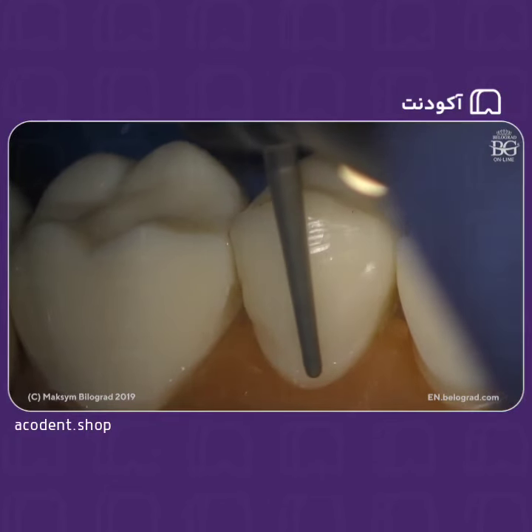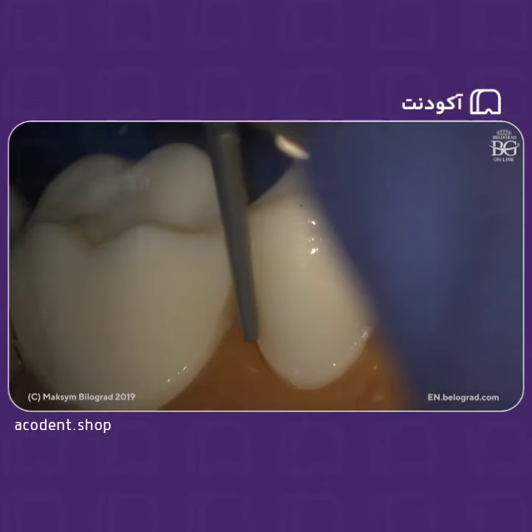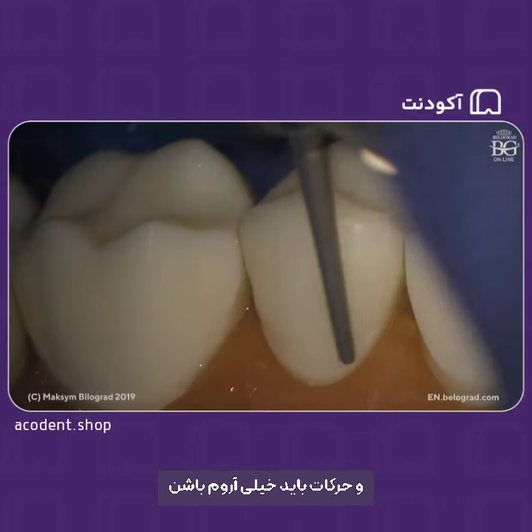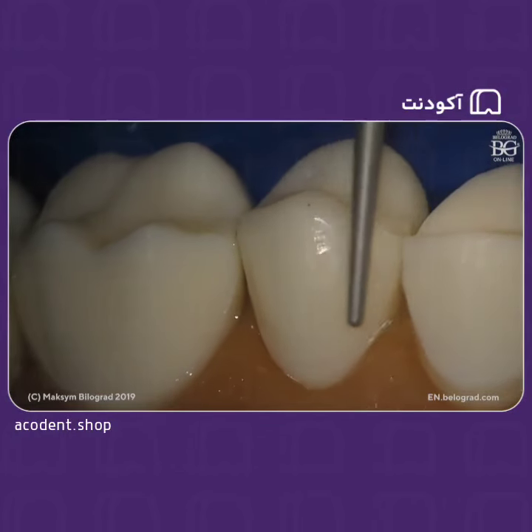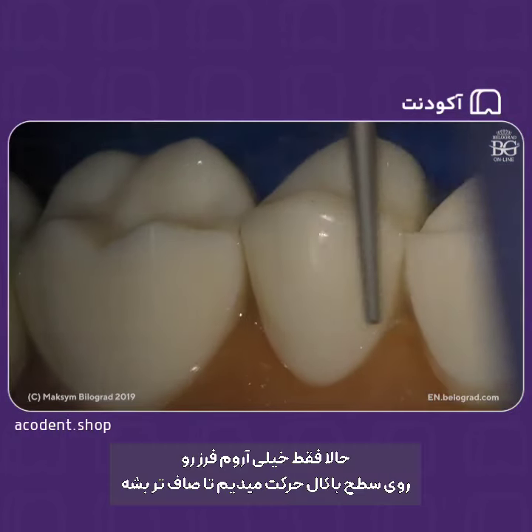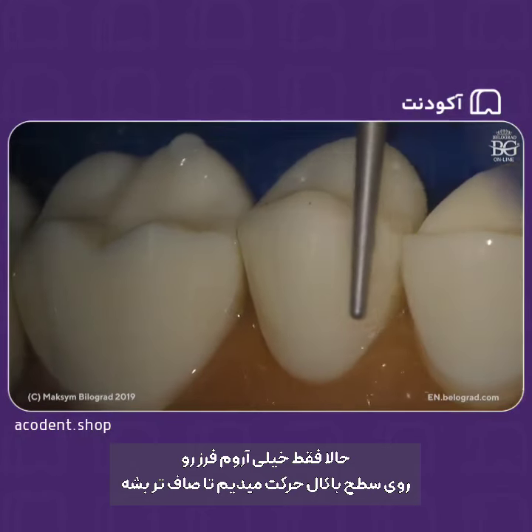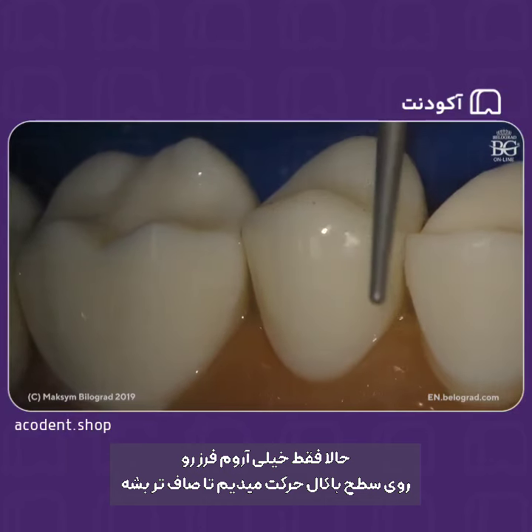Okay. Make preparation really smooth. Movements have to be smooth. And now just moving your burr really gently over the buccal surface to make it smoother after this medium grit burr.